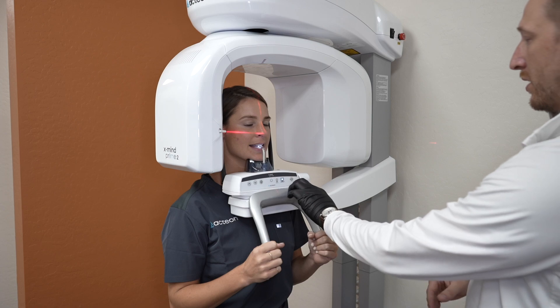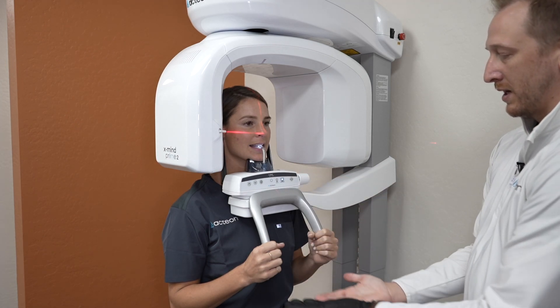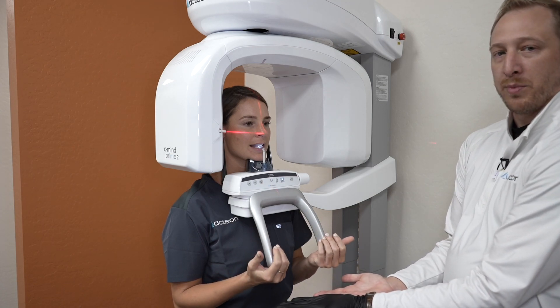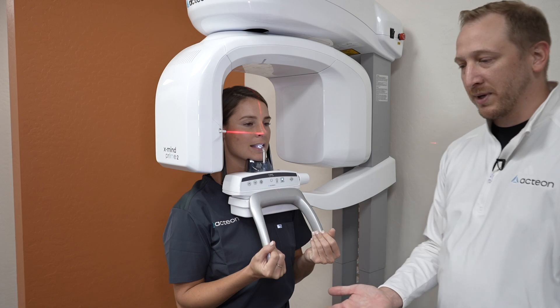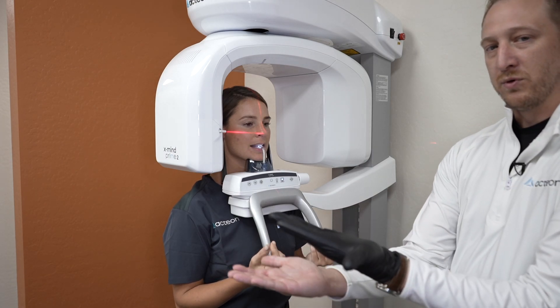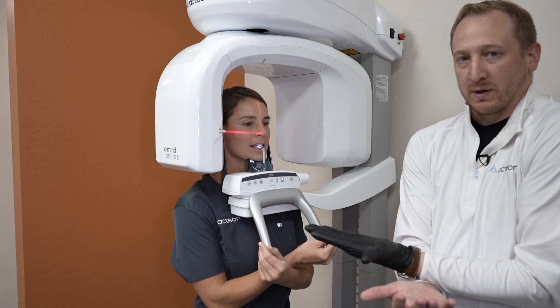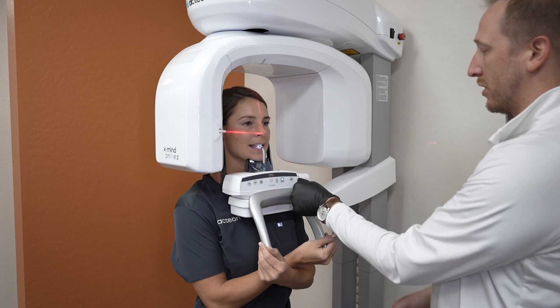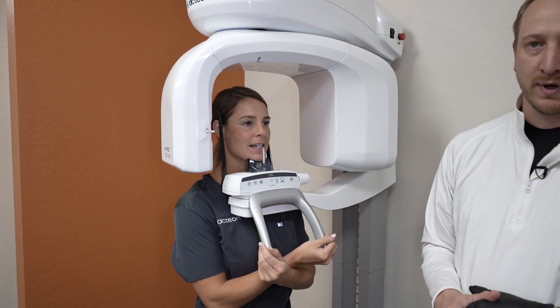We're going to go ahead and bring in our headrests. Spine nice and straight. Now we're going to take Sheridan's hands — we're going to open her palms and just have her rest the palms like that. What that does is relaxes the shoulders a little bit. If we have someone who has wider shoulders, we'll ask them to move their hands crisscross like that — notice how that tightens the shoulders in. Once we're happy with the positioning, we're going to go ahead and hit our reset button and that'll get the machine set for imaging.